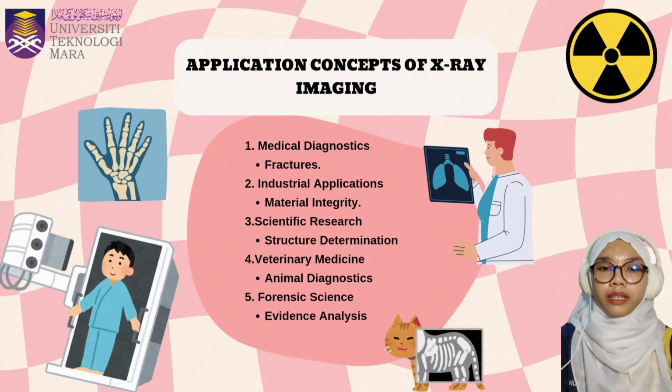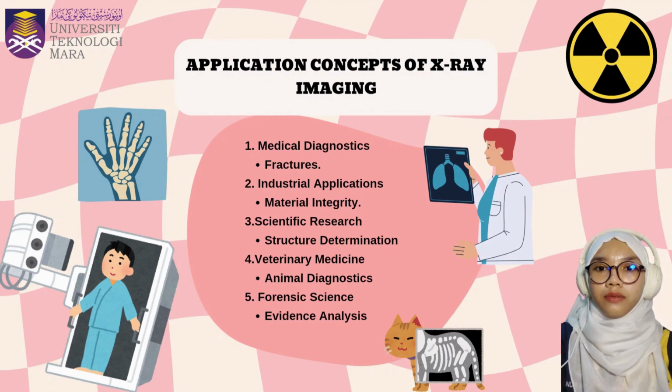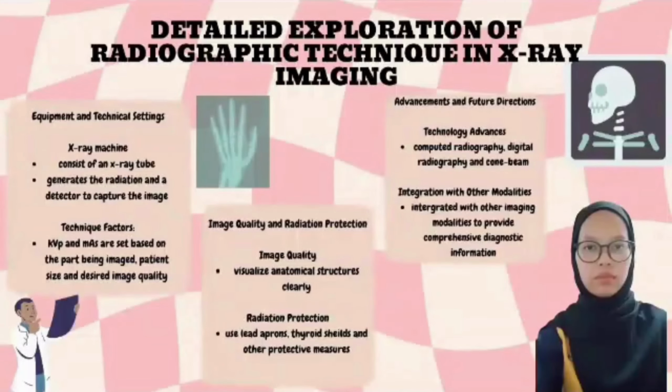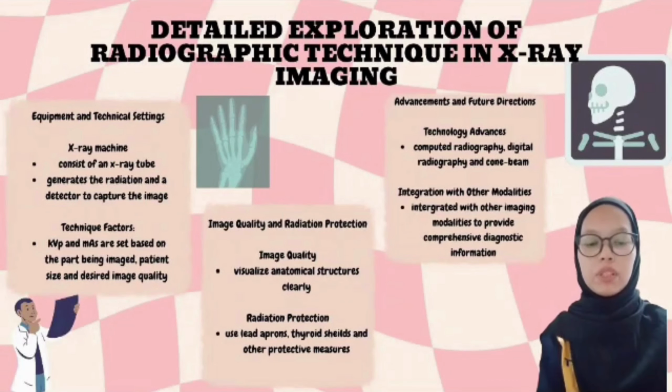X-ray imaging applications span a wide range of fields, leveraging the technology's ability to non-invasively visualize internal structure. Advances in imaging technique and digital processing continue to expand the utility and effectiveness of X-ray imaging in various applications. I will continue with the detailed exploration of radiographic technique in X-ray imaging.